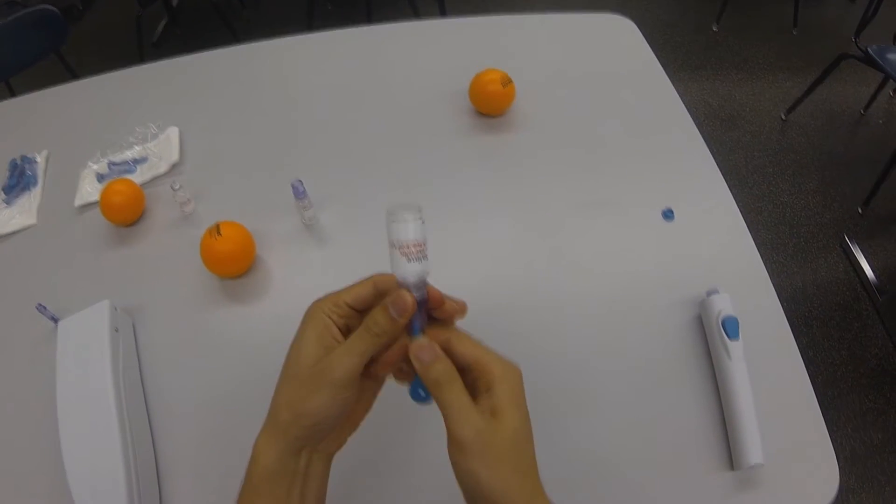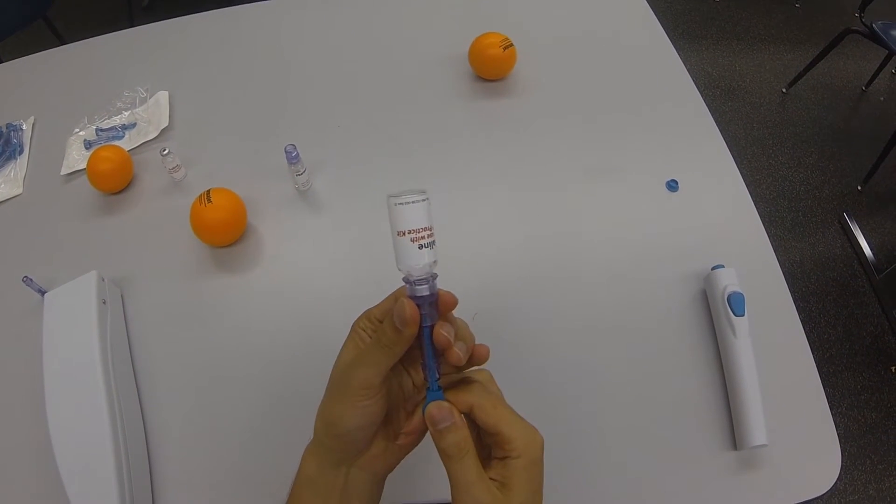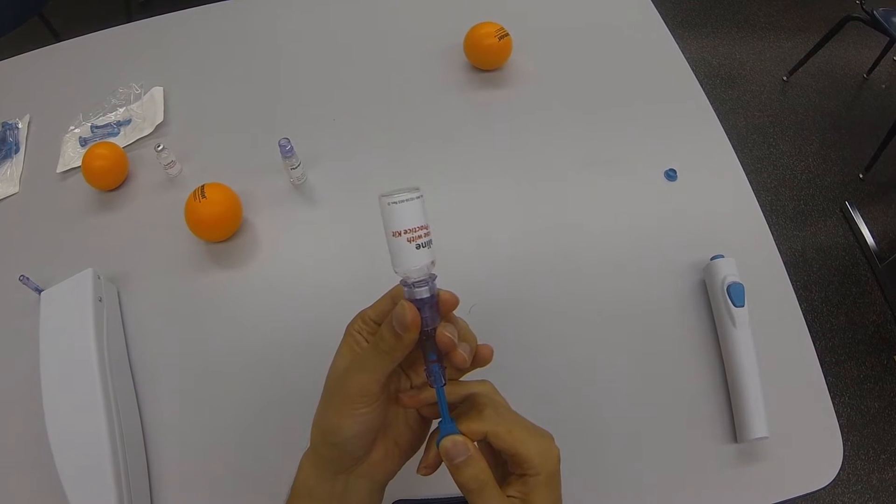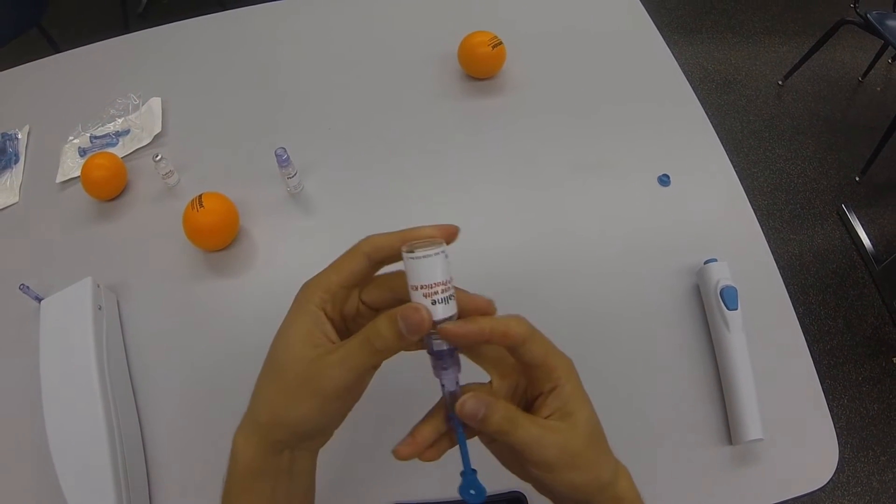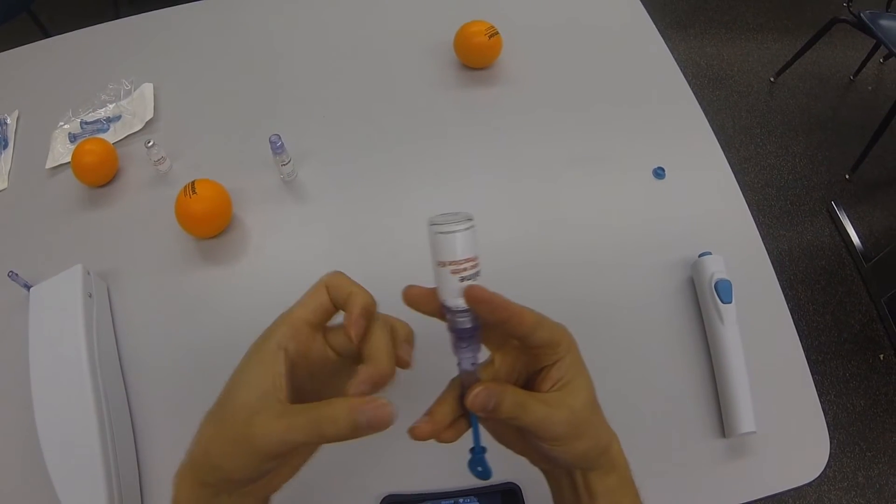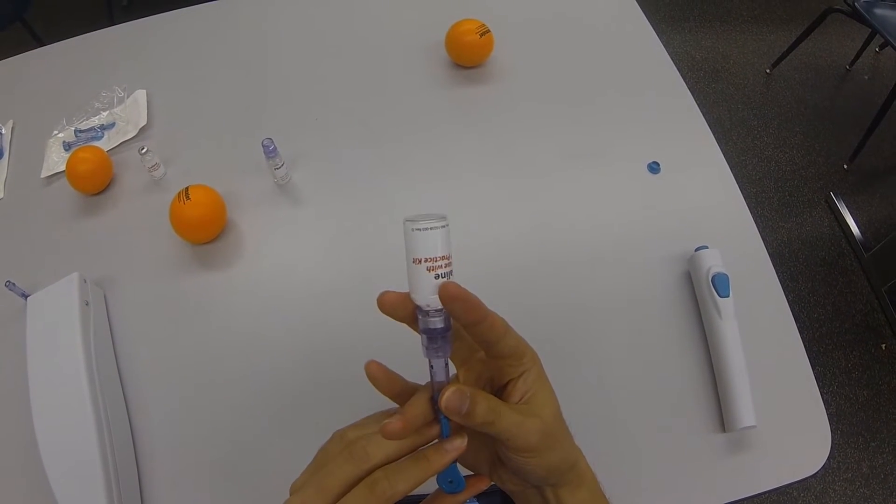Now pull the blue plunger down to draw the dose. If you overfill, this is fine because the injector automatically adjusts for the dose. You can hold the bottle by your index and middle finger to stabilize it while you flick away any bubbles. You can readjust your dose as necessary.